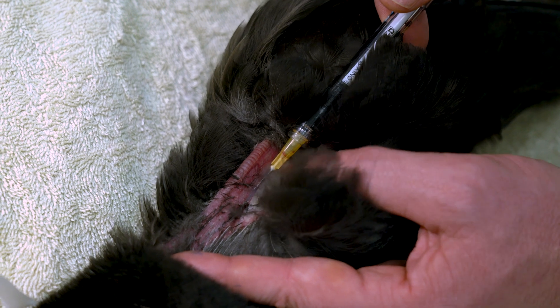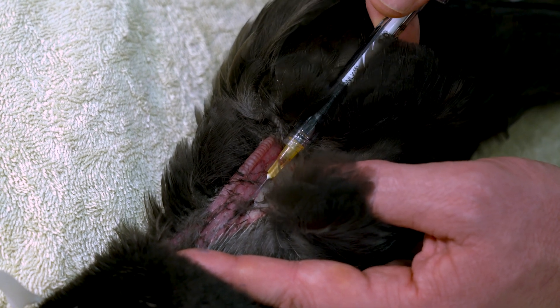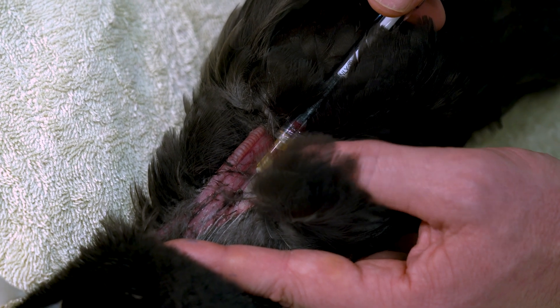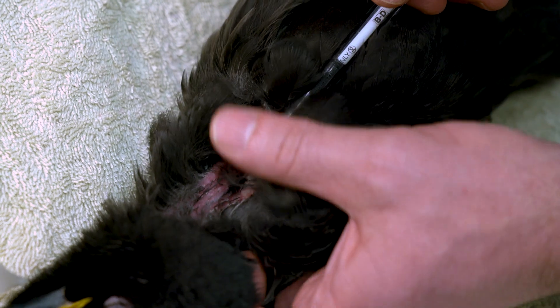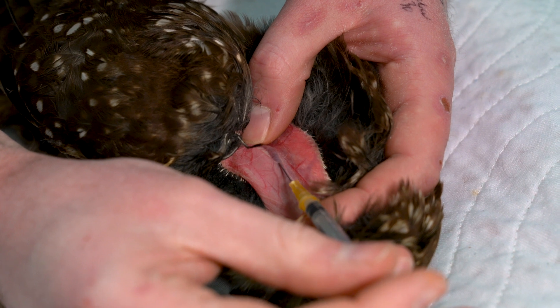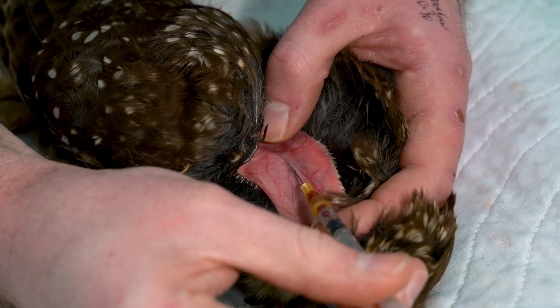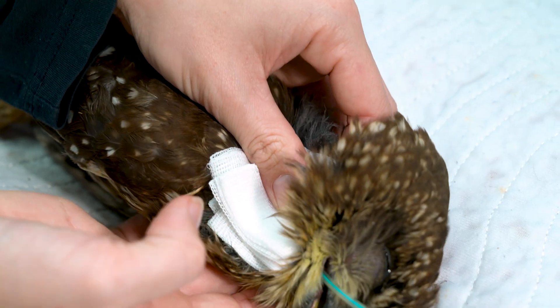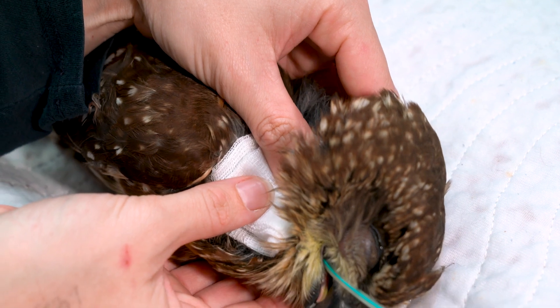When I need blood for biochemistry or hematology — so a high volume — I will most often use the jugular vein. In birds, the right jugular vein is easily accessible, and very conveniently there is a bald patch on the right side of the neck in most birds where the right jugular vein is readily accessible. After any blood collection, make sure that you press with a gauze to avoid hematoma formation and continuous bleeding, especially from the jugular vein.